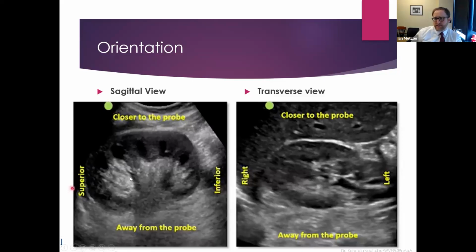When the patient is set up, let's say, in a supine position, and it's a left-sided surgery, well, I'm on the left side of the patient. My ultrasound is usually across the table from me, and so the patient's head is going to be to my right. Well, I'll switch the image with a left-right flip of just the way the image is presented, in order to get that imaging modality aligned with what I'm looking at in terms of the patient. People have different opinions about that, but I find that it makes a lot more sense that if the needle is coming into the kidney from the left, it should come in from the left on the image itself. So again, this is the correct convention, but that's adjustable depending on what you prefer as the operator.